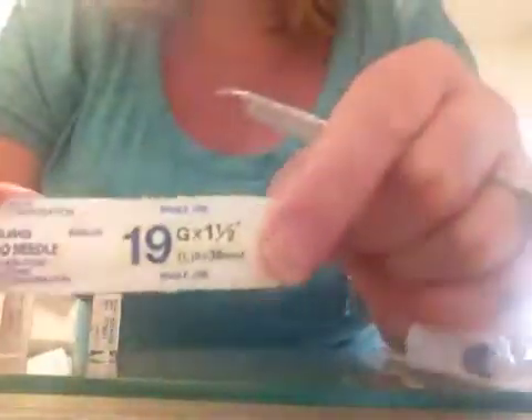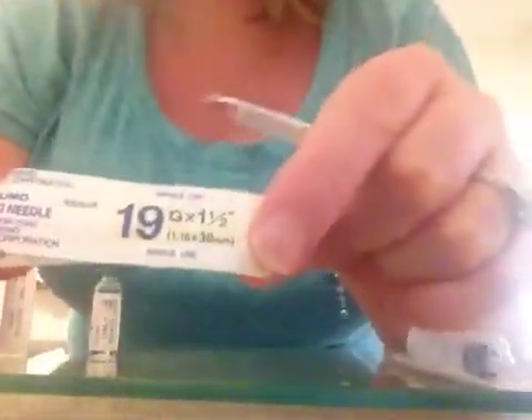At the pharmacy I got a 3ml syringe. You can have the choice between a 3ml and a 1ml — I prefer 3ml, that's what I use at work when drawing up things. I've gotten two needles. The needle with the smallest number is a bigger gauge, and the needle with the bigger number is the smaller gauge. This larger one is my drawing-up needle.